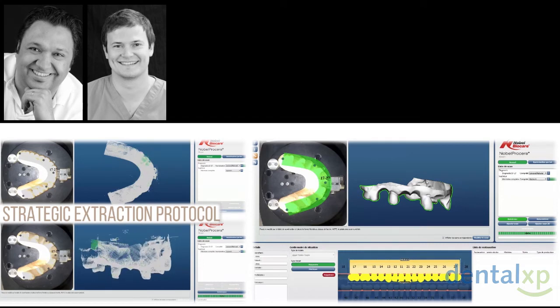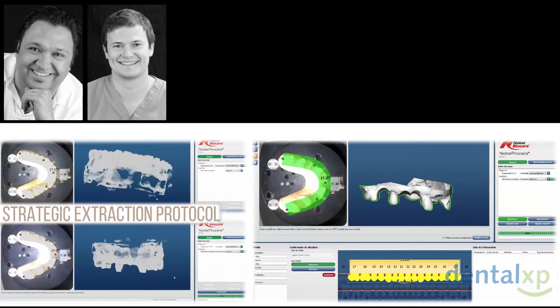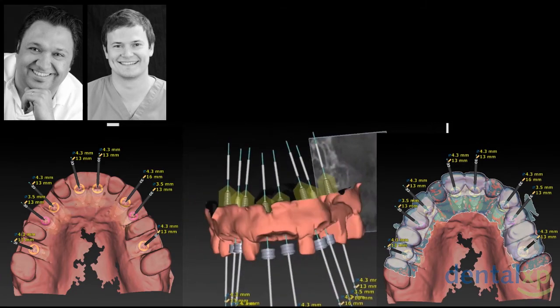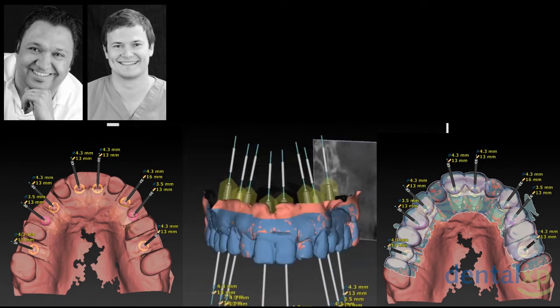If the failing dentition of the patient doesn't fit, you can do a wax up, you can try it in a mock-up, and then you can scan it. Then we cut all the teeth involved with the implant site and we scan it again. With these two acquisitions, we can superimpose them, we can merge them to the CBCT files of the patient, just like we were showing you before. We can do the planning the same way, very precise, very accurate procedure.